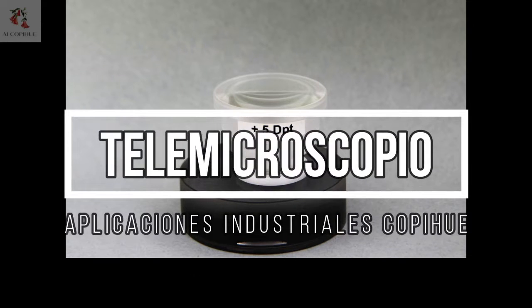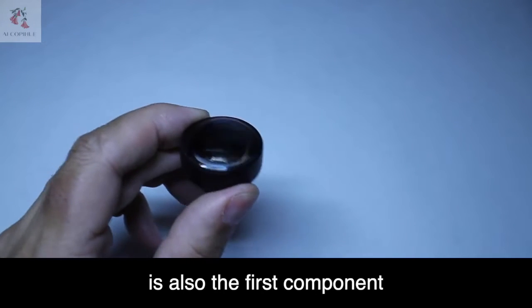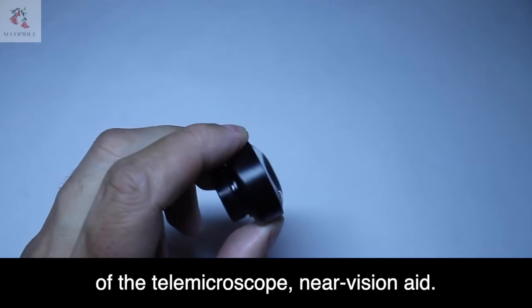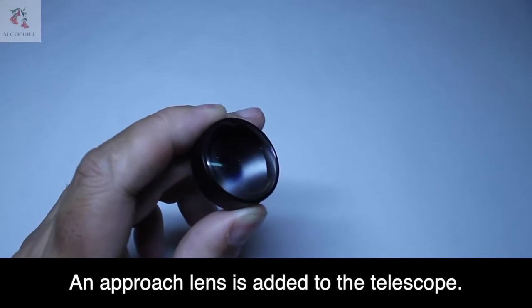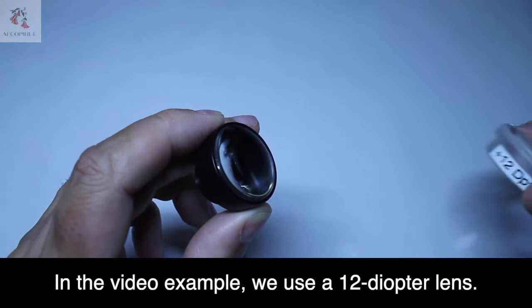The telemicroscope. The TCC2X telescope is also the first component of the telemicroscope near vision aid. An approach lens is added to the telescope. In the video example, we use a 12 diopter lens.